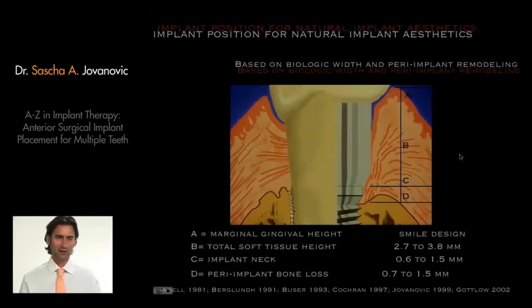So let's focus now on implant position then. And this is similar to single teeth, but it has an additional touch to it, and I'll bring that forward in a moment. I'll summarize again what we discussed for single teeth. This is where we're going to be focusing on.